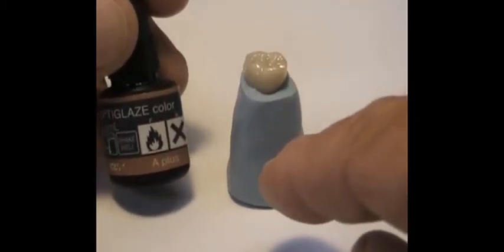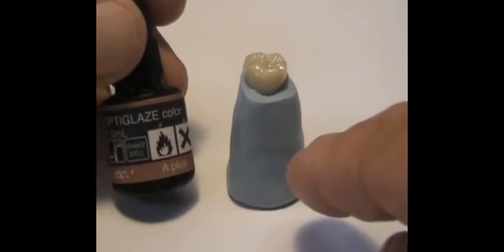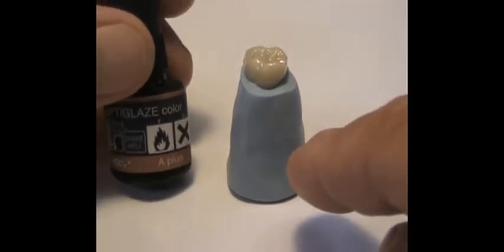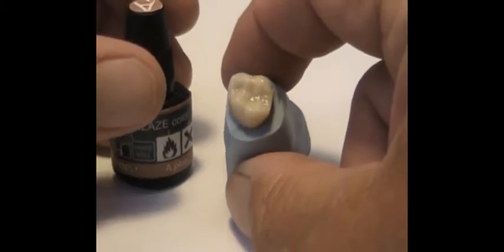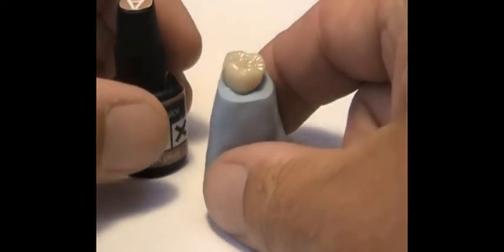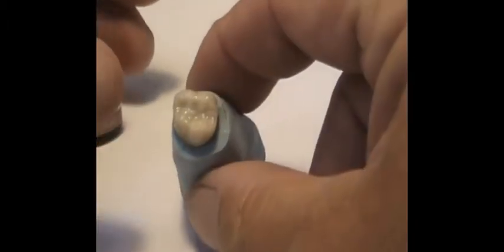For clinicians it's great because you can do this chair side. If you have a temporary you'd like to doll up while you have the patient in the chair, you can literally match the shade of the tooth and match the occlusal anatomy — cracks, fissures, and discolorations — simply by putting it in, taking a look, coating it, putting it back in the patient's mouth, checking the shade, and changing it. Then you can bring out some browns.